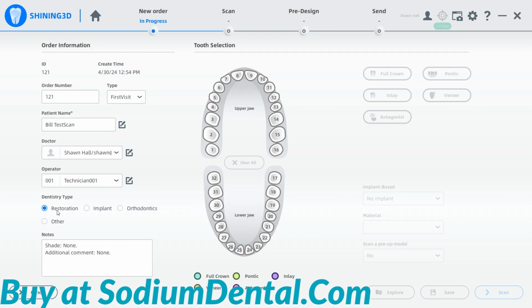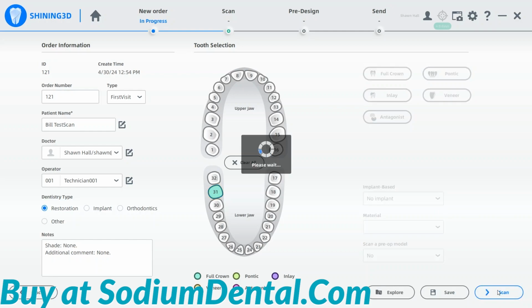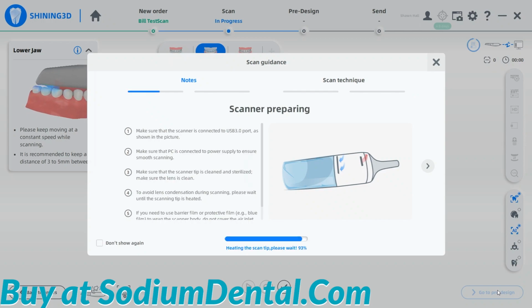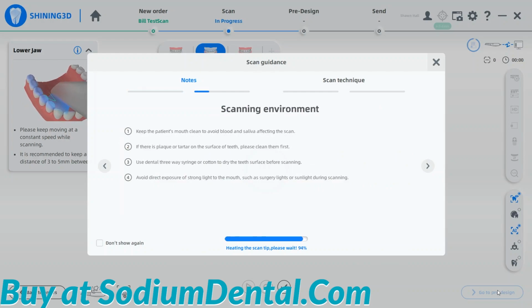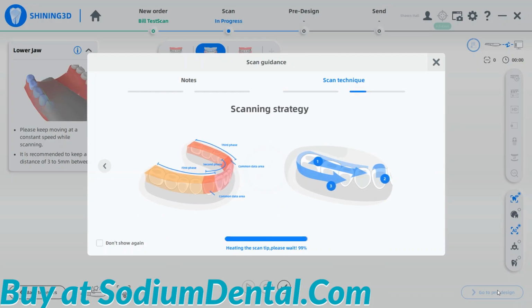For a restoration case, simply select the tooth that you want to do a restoration on. You can clear teeth if you chose the wrong tooth. And we will start the scan. The scanner software will give you great advice as to how to use the scanner. You can choose not to show the advice again if you don't want to see it, but it gives you helpful information like the scanner tip is heating. You want to wait till the scanner tip is 100% heated.